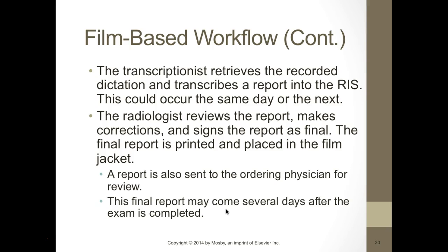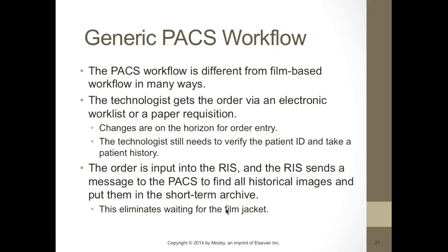Then the radiologist reviews the report, makes corrections, and signs the report as final. The final report is printed and placed in the film jacket. A report is also sent to the ordering physician. We'd have couriers that would go take the reports, or we would fax them. The final report may come several days after the exam is complete. So with the PACS system, the workflow is different in the sense that it's so much faster.